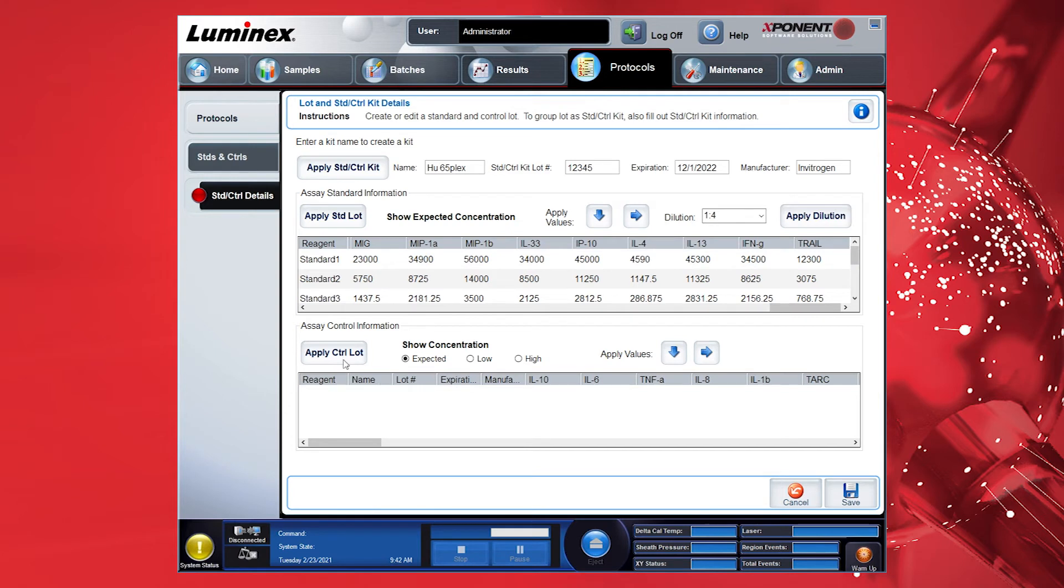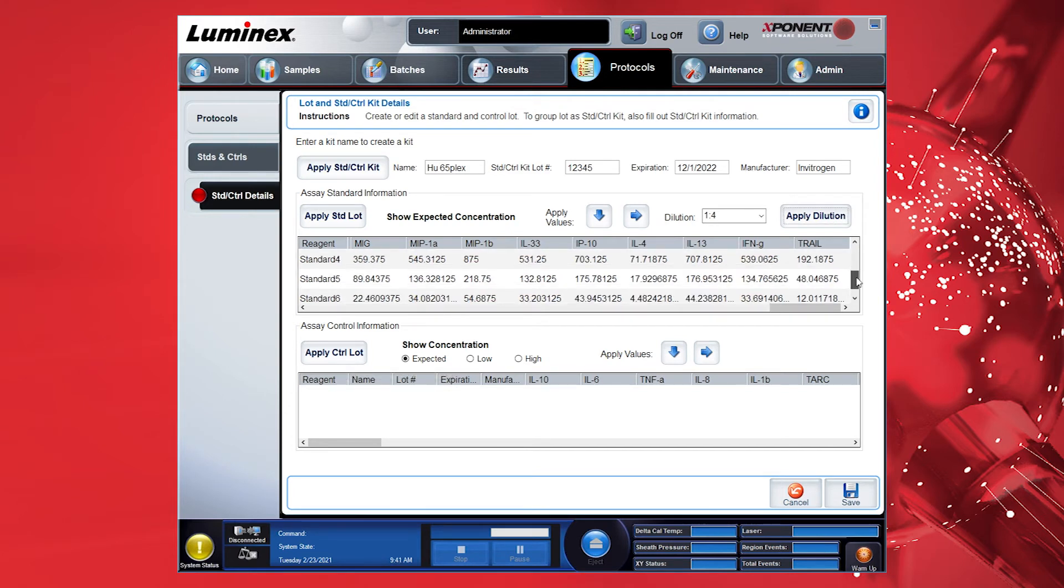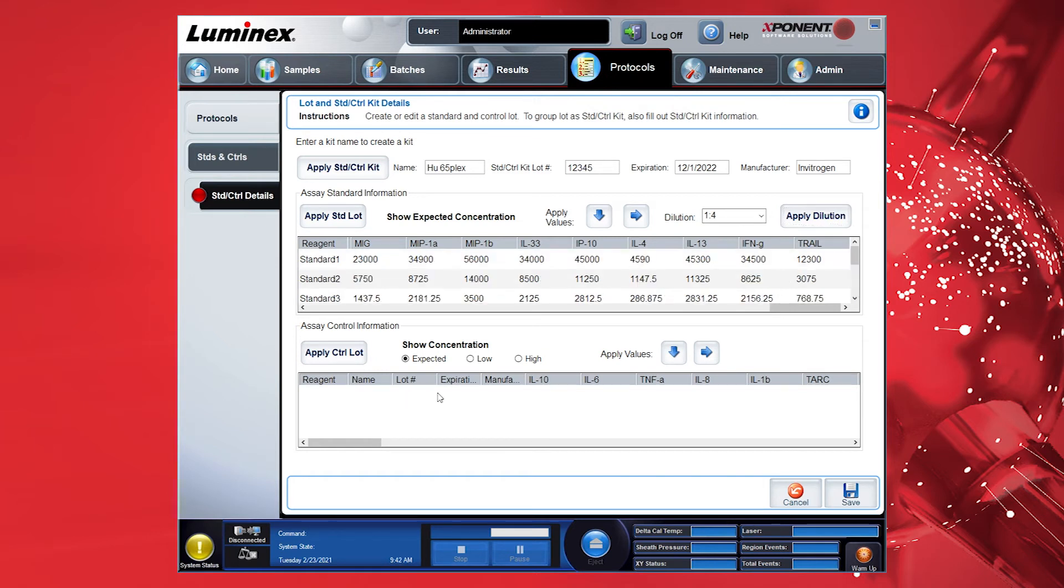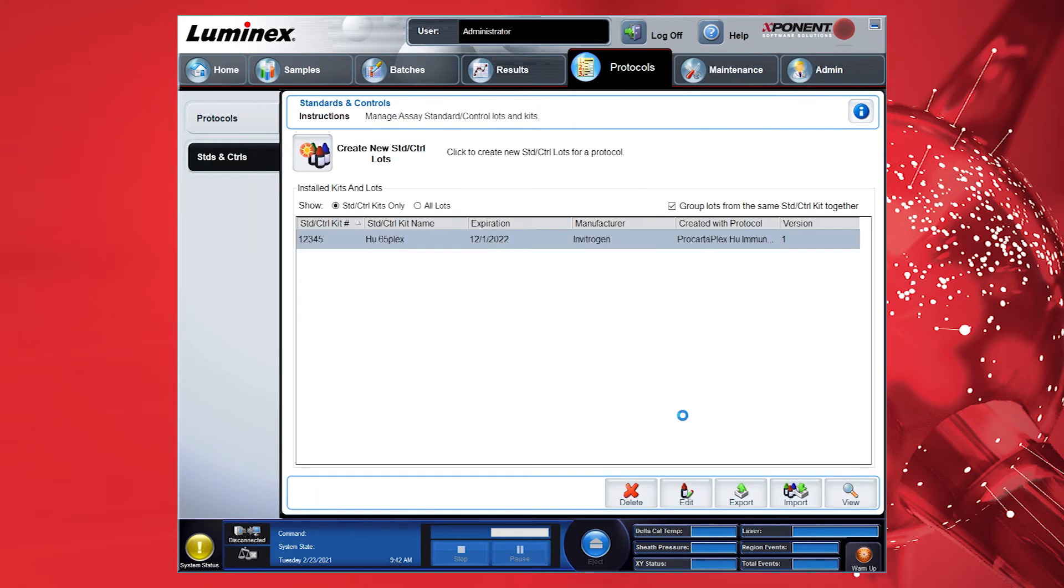You can ignore the Apply Controls Lot section when running a quantitative assay. However, this section will be required if controls were chosen in the Protocol Setup screen. Click Save to save the lot-specific standard information which can be used in other protocols that use the same targets.